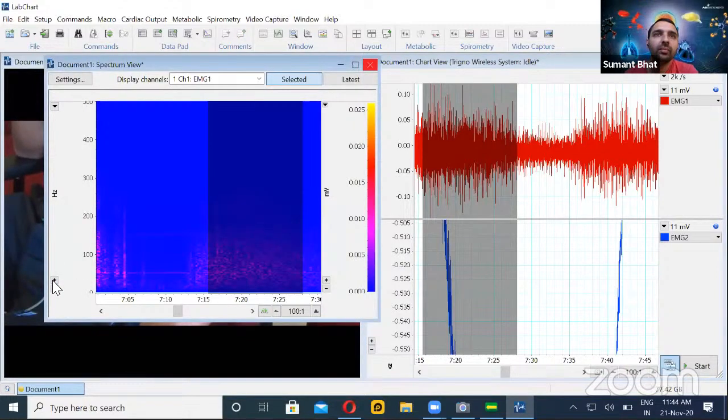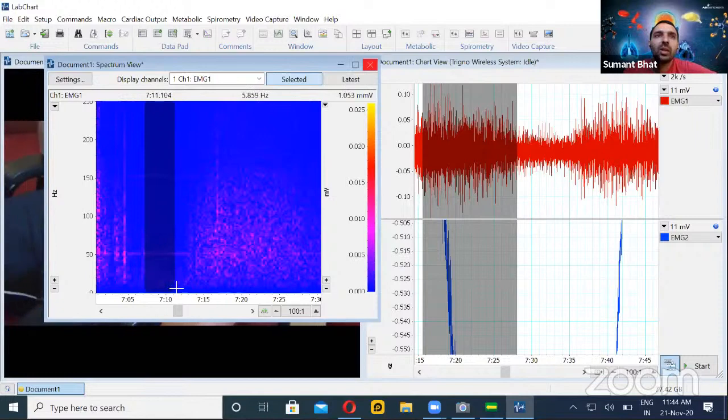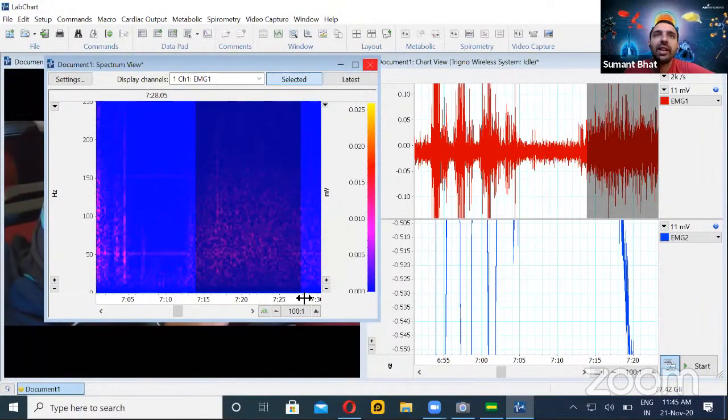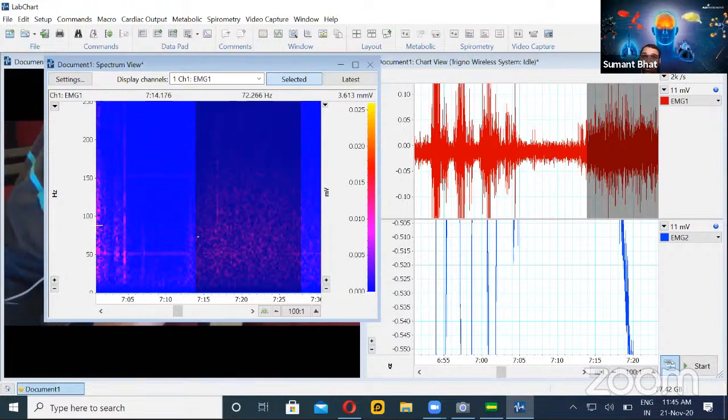You can see color changes in the band of roughly 0 to 200 Hz. In the resting portion, there are not as many frequency components as in the contraction phase — this is very clearly evident. This gives a rough idea of the frequency distribution of a contraction — what frequency the muscle fibers are firing. It is spread from about 20-30 Hz up to 150-200 Hz. This is a good tool to decide your filter or analysis band.